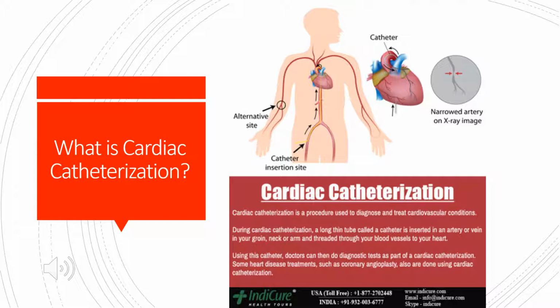Typically, this procedure will be done on an outpatient basis unless the patient has other underlying medical conditions. Some of these medical conditions may include a myocardial infarction, heart failure, or other complications that may have arisen during the procedure. Patients are typically awake during this procedure but heavily sedated, while a local anesthetic is used to numb the area where the catheter is being inserted.